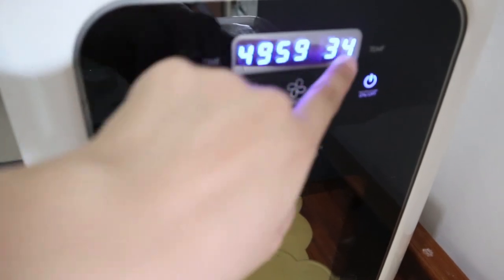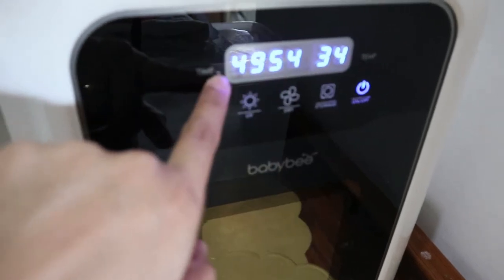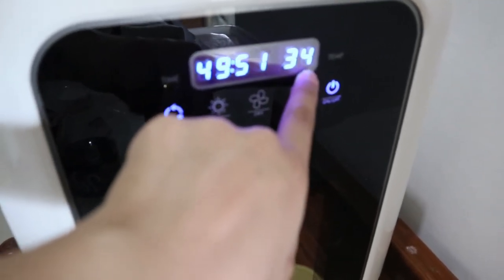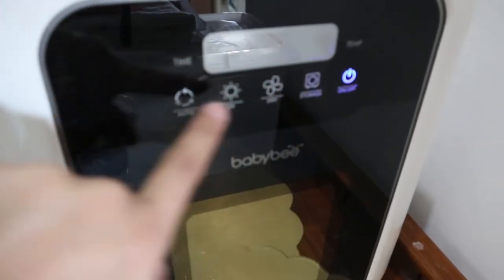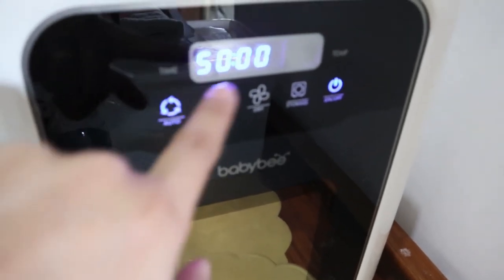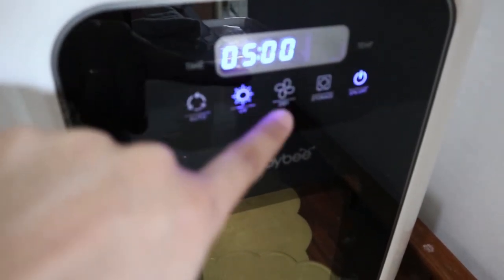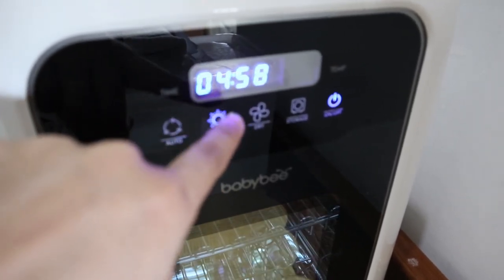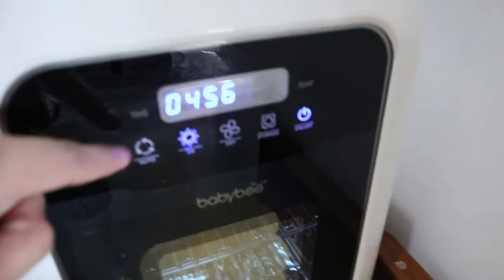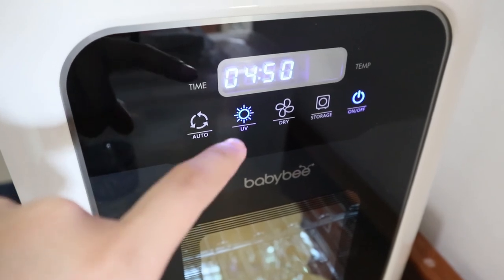Tapos, meron siyang time and at the same time, temperature. So, ito din. Oops, sorry, napindot ko. Isa pa. So, there. 50. So, at the same time, meron siyang temperature. Right? Ito yung UV. Uy! May mas mababa ng time. 5 minutes. Kasi yung mas maliit is yung mas maliit is 11 minutes ang kanyang pinakamababang time.